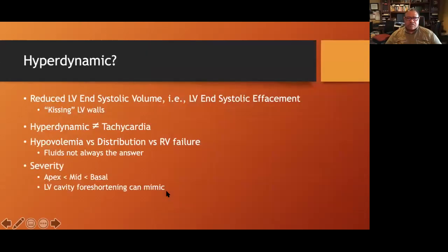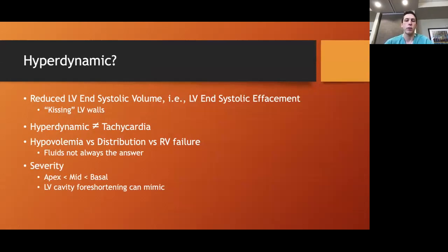Okay, so this term hyperdynamic, I think it's thrown around a lot, so I think it's useful that we really clarify what this means. And the technical definition is this left ventricular end systolic effacement, or this kissing of the left ventricular walls at the end of systole. And being hyperdynamic should not be confused with being tachycardic. You can certainly be tachycardic and not hyperdynamic, and you can be bradycardic and hyperdynamic. So they're not the same.